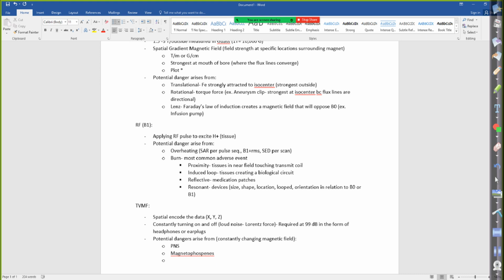And then obviously the devices as well. We didn't hit on it as much, but depending on their length and their shape, if you have some kind of electrical component to a device and a changing magnetic field, you can induce a voltage in that. That's why stimulators, like those deep brain stimulators and neurostimulators you watched videos on, matter.